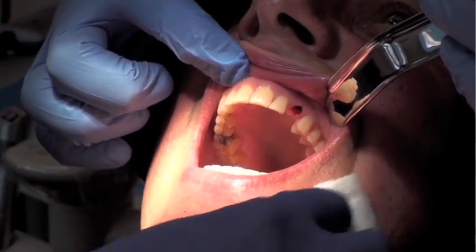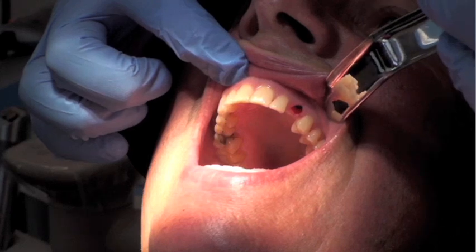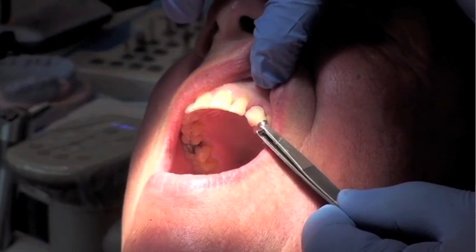You can see that the tissue punch, because of the profile of the gingiva, has created an ideal zenith. This zenith would essentially allow us to create the ideal or optimal aesthetics in terms of emergence profile.